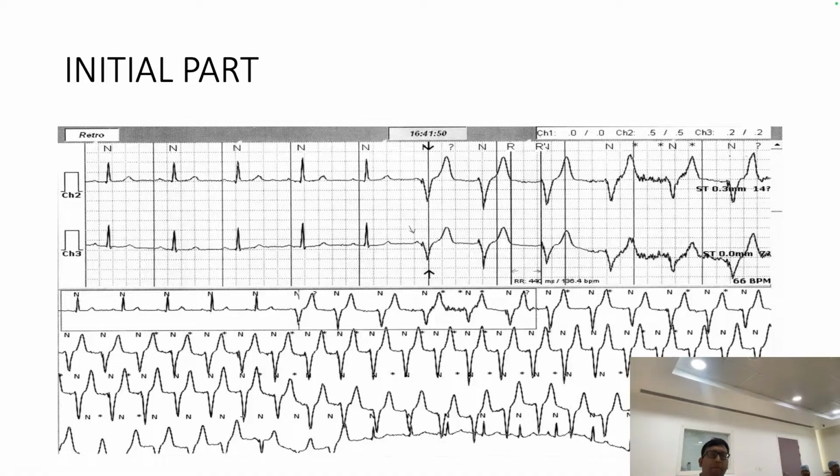Any comment? I know the answer. The person who knows the answer should not say it, but I want answers from the house. It's like PMT. Okay, for PMT, pacemaker mediated tachycardia, what are the two things required? Yeah, Madhu. Sanjay, I think Sanjay or Srikant, I expected an answer. Tell me, what is happening?